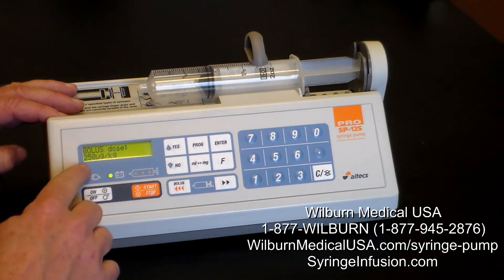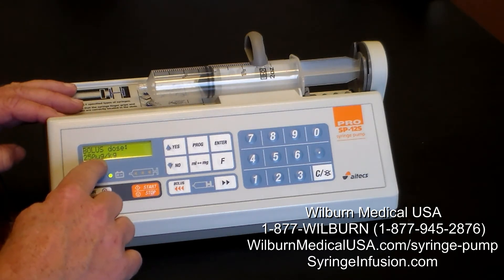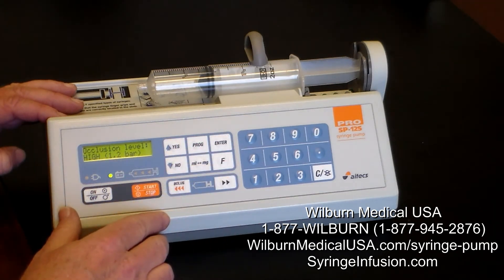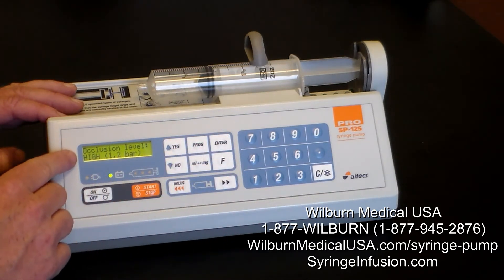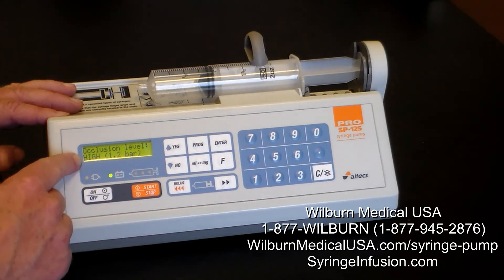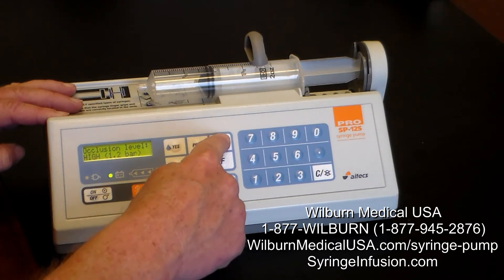The bolus dose — I've got in here, for example, 250 micrograms per kilogram. We'll keep that for our demonstration and press enter. We have an adjustable occlusion pressure alarm. Many clinicians choose to keep it at the high level to prevent inadvertent occlusion alarms. We press enter.